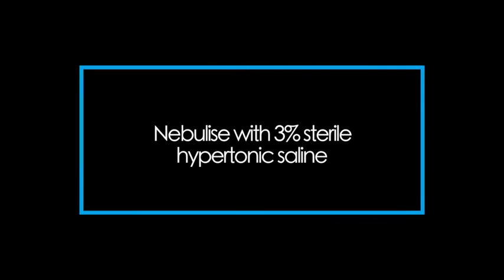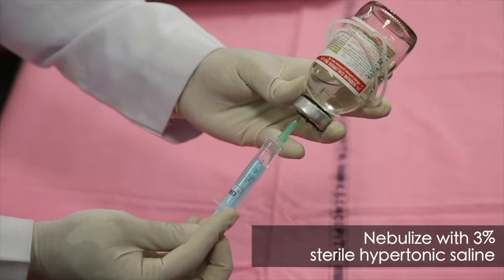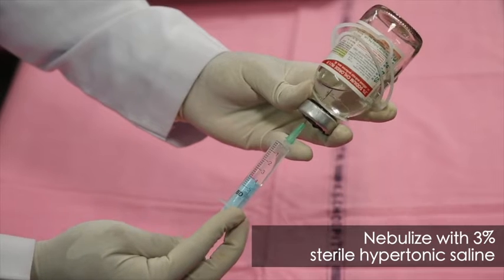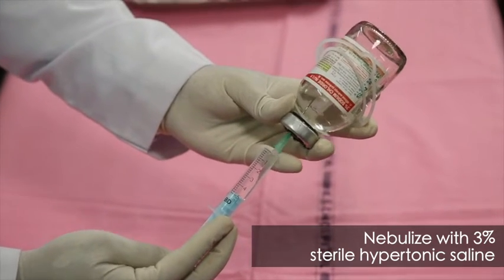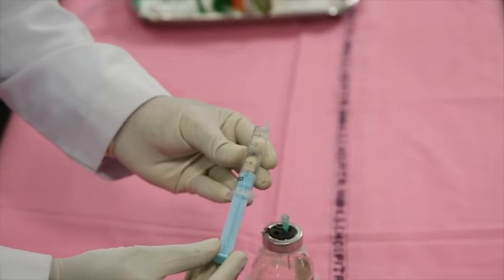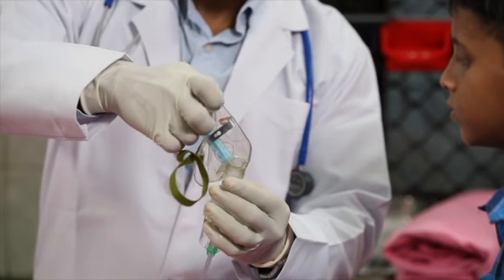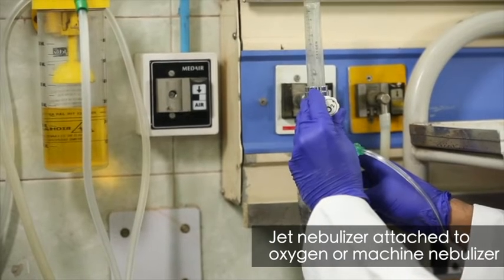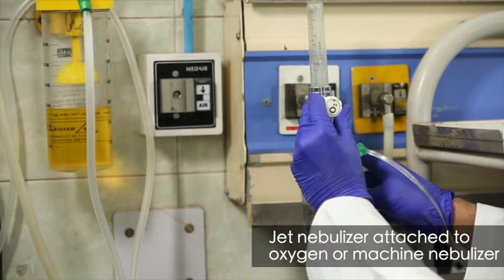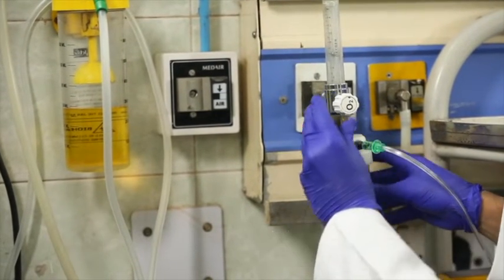The next step is to nebulize with 5 ml of 3% sterile hypertonic saline. Use a sterile, commercially available preparation. Nebulization can be done through a jet nebulizer attached to pressured oxygen or air supply at the lowest flow rate needed to produce adequate mist, which usually is 5 to 7 liters per minute.